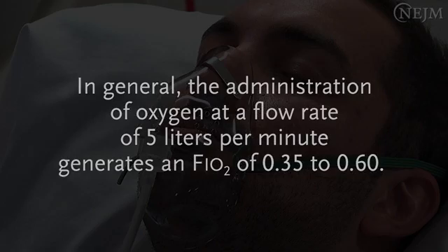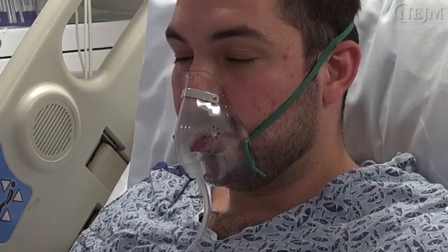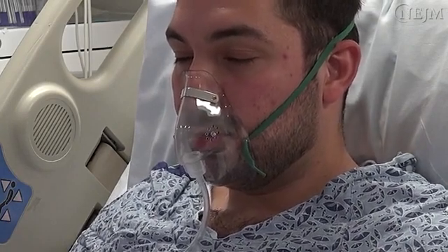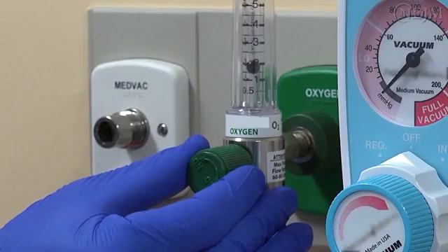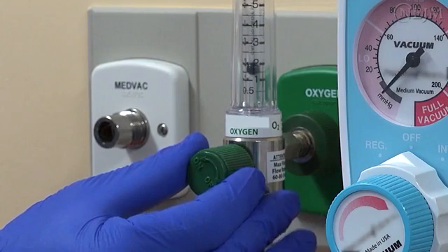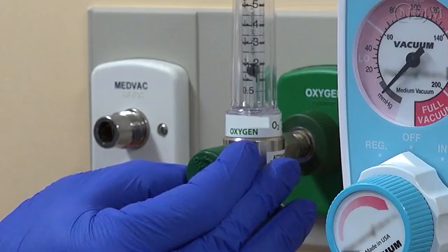to 0.6. Condensation of water vapor in the mask provides a visual cue of expiration and is rapidly cleared when appropriate fresh gas flow is provided. Disconnection of the oxygen tubing from the source or a low oxygen flow rate can cause the patient to receive insufficient oxygen and rebreathe exhaled carbon dioxide. These problems should be addressed immediately.